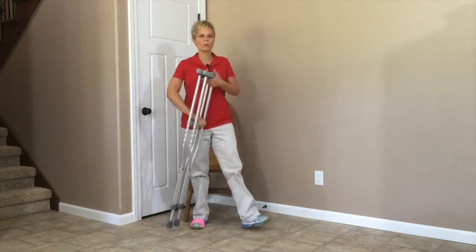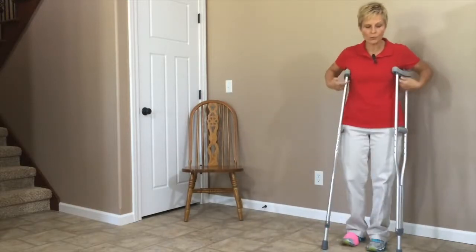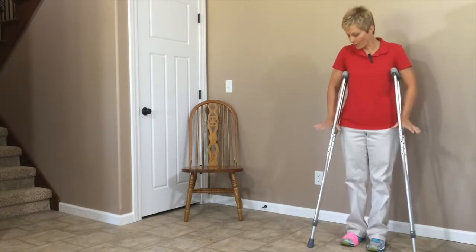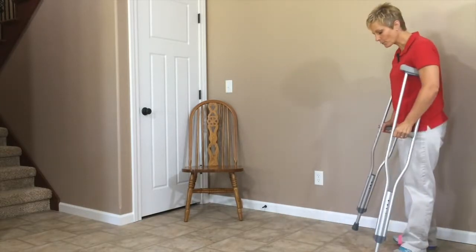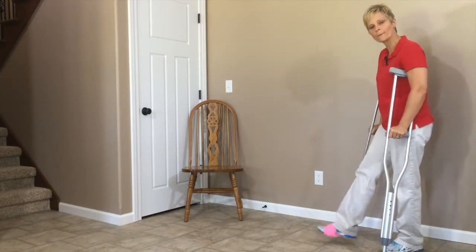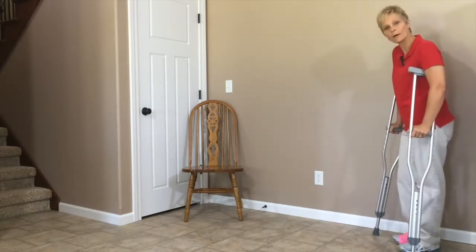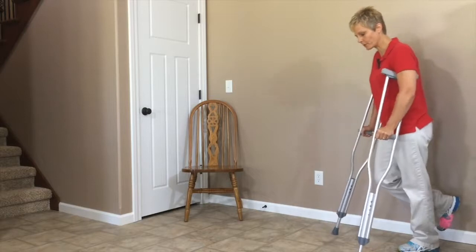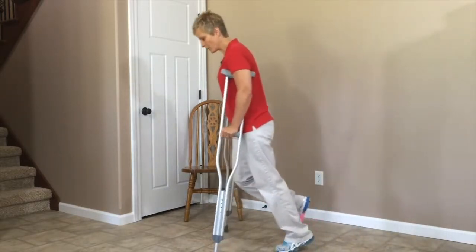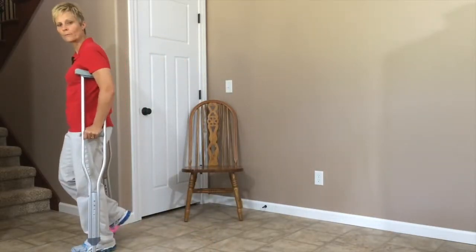Now I'm going to show you how to walk with these if you are non-weight bearing. When you're walking, you're not hanging on the crutches with your armpits — the pressure has to go through your hands. Some people will bend their leg back, some will put it forward, depending on your stability. When walking non-weight bearing, you're going to put the crutches forward and swing through with your good foot. Crutches forward, swing through with your good foot, crutches forward and swing through.